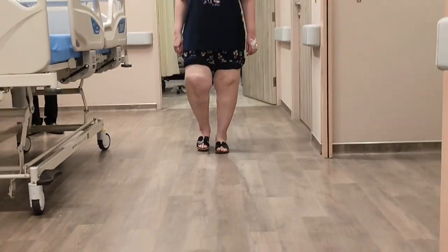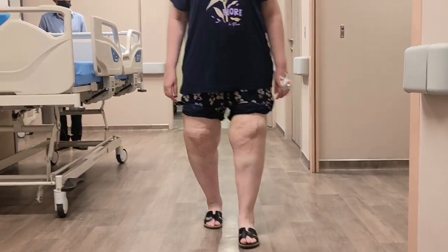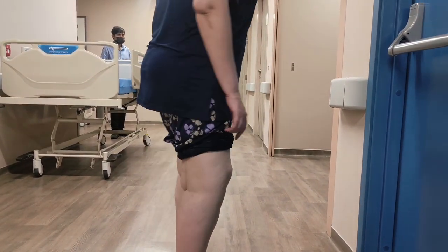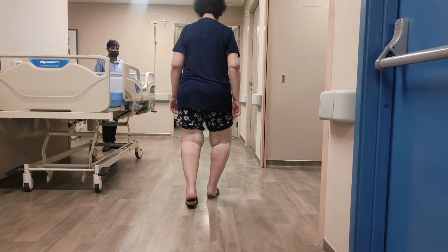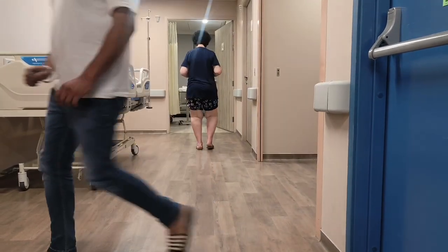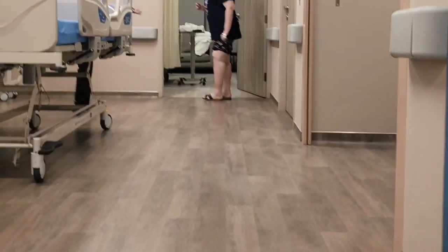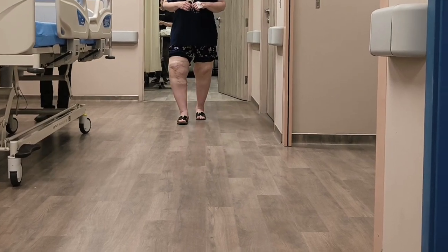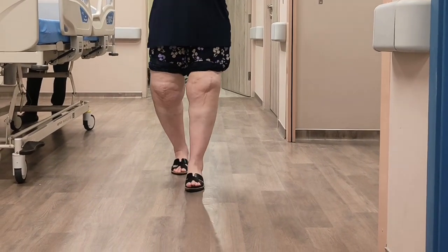The deformity on the right side — there are various deformities. The right leg is completely rotated back again. It was a replacement done 8 years ago, but slowly the right leg has hurt again and the deformity is back. This is because her implant is loose again. Her implant is loose on the right side, so this is a failed implant. The tibial implant is loose and the deformity is back again.